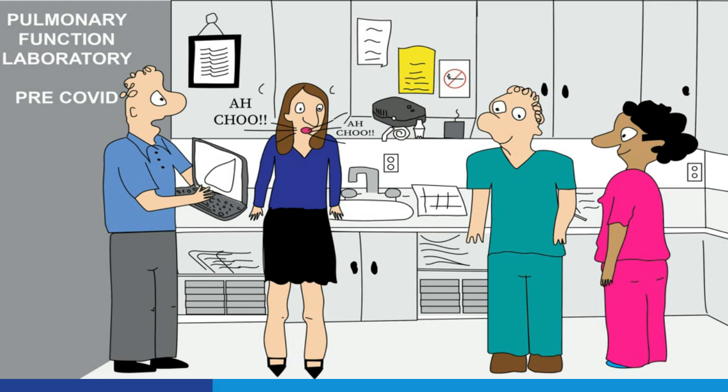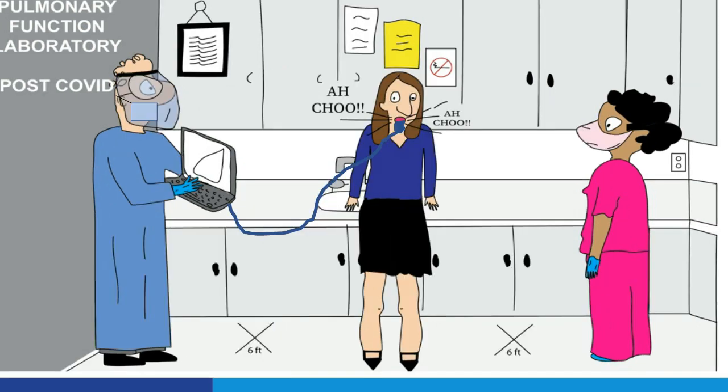This is a cartoon that was done by Val. She works for the American Lung Association as well, kind of showing you the idea of what the old days were. We have patients coming into the laboratory, we're doing the spirometry, and other staff members, nobody ever wore a mask. Staff members were kind of hanging around, and there was no social distancing. And this cartoon is showing more full PPE, right? And more distance between us and the patient, and of course, the increased wait times and things like that.